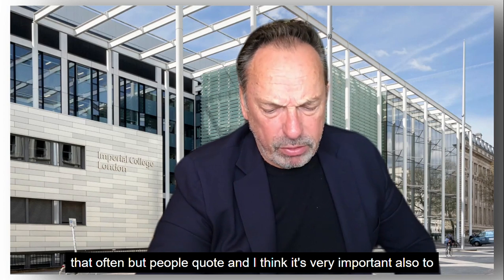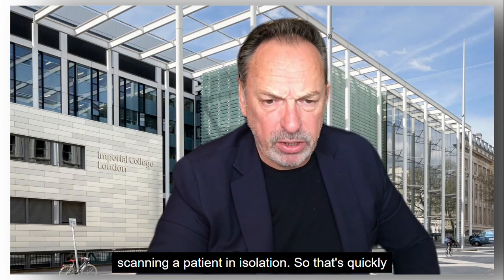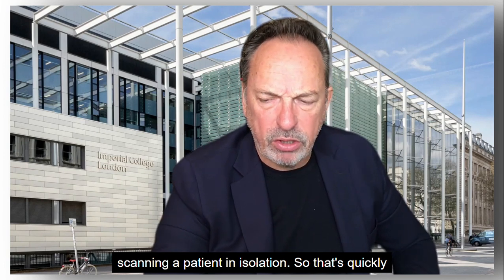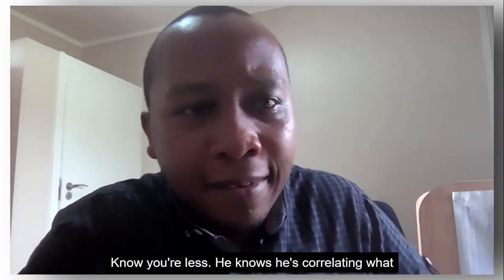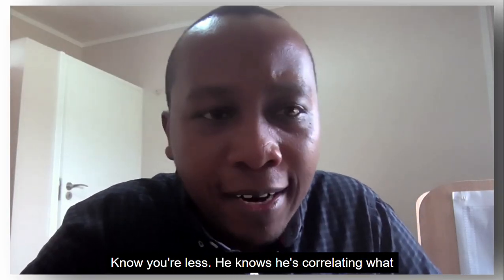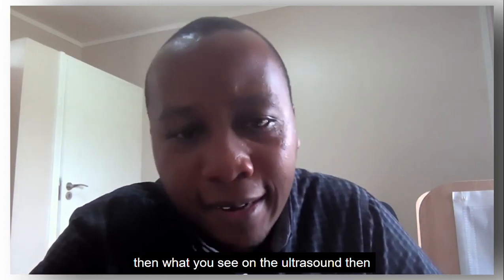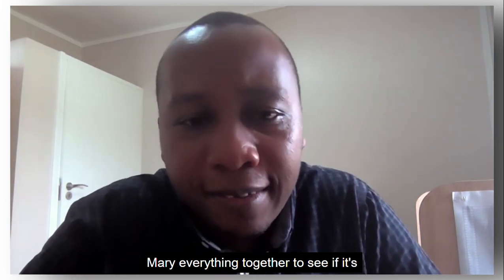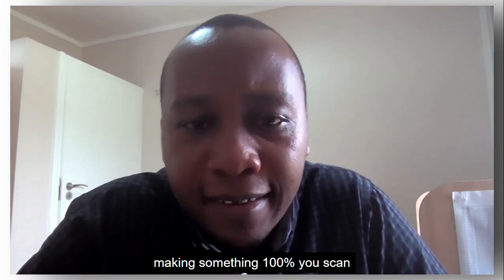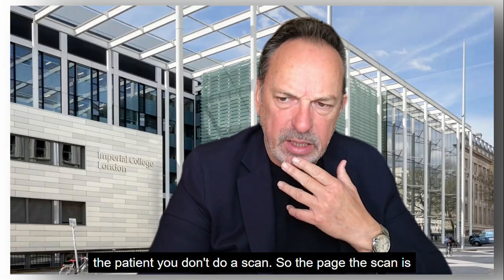And I think it's very important also to listen to the patient and listen to the history as well. You're not scanning a patient in isolation. So that's quickly trying to go through the questions that have come up on the chat. Thanks, Tom. I think your last keynote is correlating the history, what you see on physical findings, and then what you see on the ultrasound, then marry everything together to see if it's making any sense. 100%. You scan the patient. You don't do a scan. The scan is part of the situation.